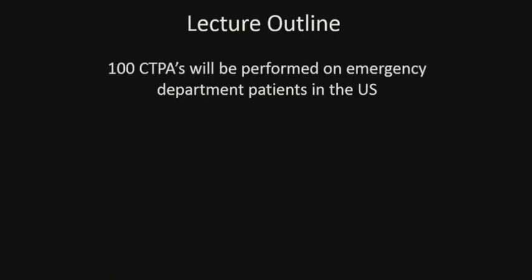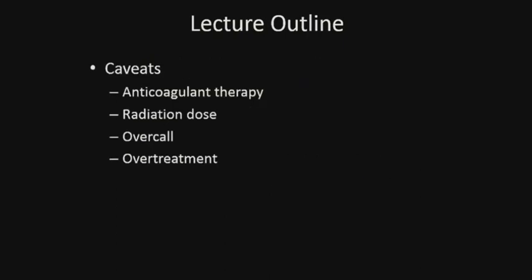By the end of my talk, 100 patients in emergency departments around the US will have undergone CT pulmonary angiography. That's according to a study by Niska and colleagues in 2007, and it demonstrates how popular CT pulmonary angiography is. And the reason behind that is from PIOPED-2 data and more recent experience, CT pulmonary angiography has a very high sensitivity and specificity for pulmonary embolism.